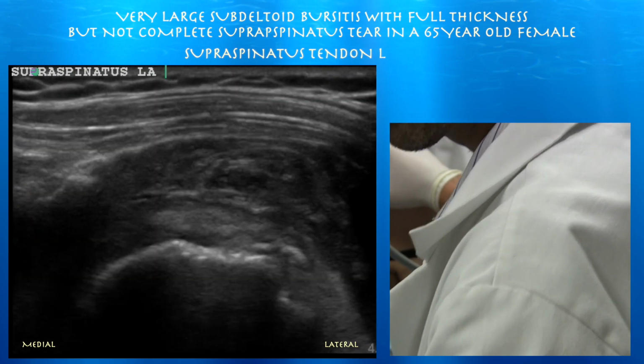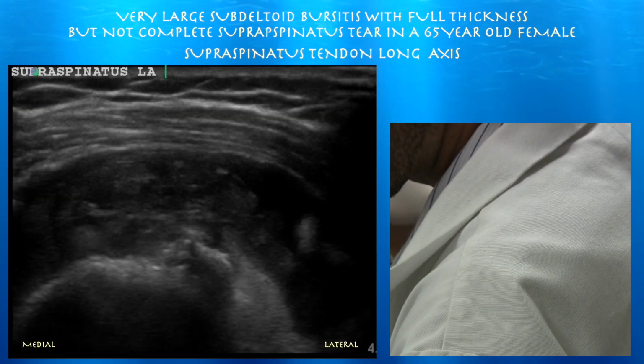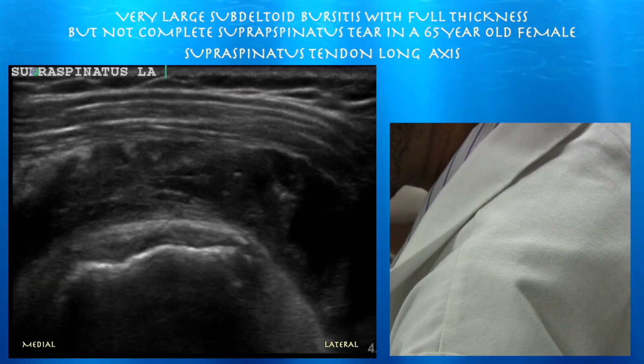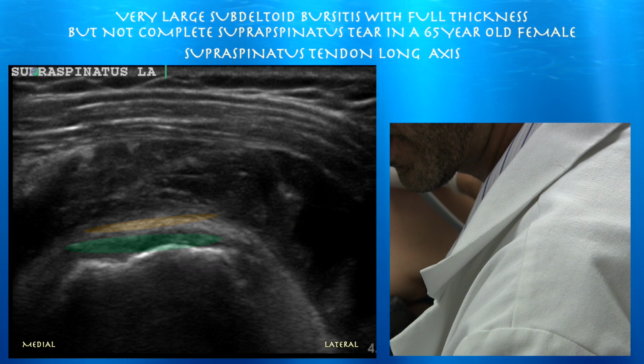I'm going to try to now look at her supraspinatus tendon. You could see some fibers, but it does look quite thin. Certainly you do see some fibers attaching on the greater tuberosity, but it does look thin. The bright signal above that, I believe, is the interface between the subdeltoid bursa and the supraspinatus tendon, so that should not be mistaken for tendon itself.